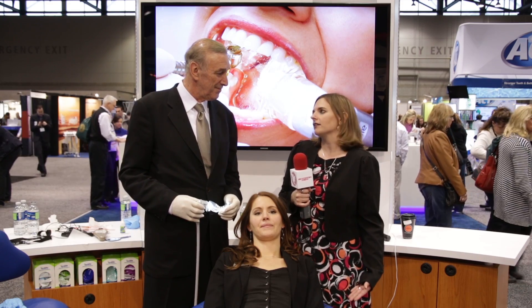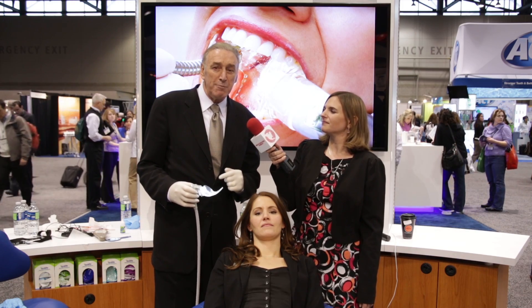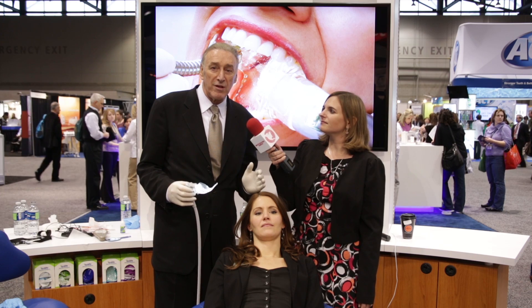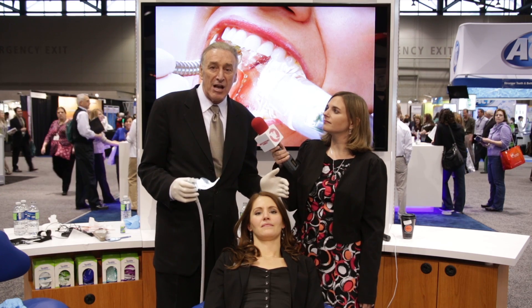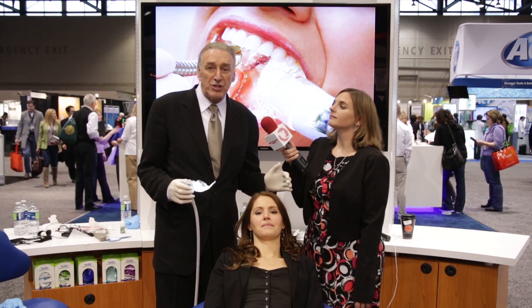Dr. Hirsch, can you first tell us how does Isolite differ from other traditional dental isolation systems? The Isolite system differs in this way: it puts us in total control of the oral environment. I don't have to worry about my patient compromising the quality of the work that I work so hard to achieve.